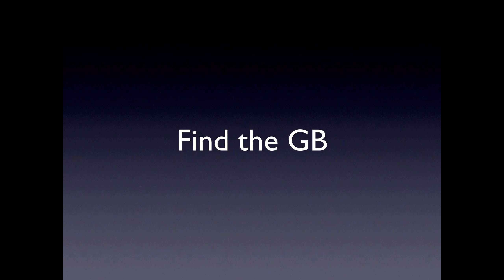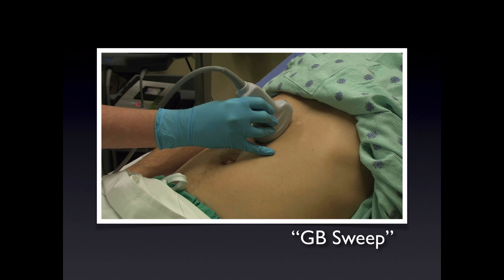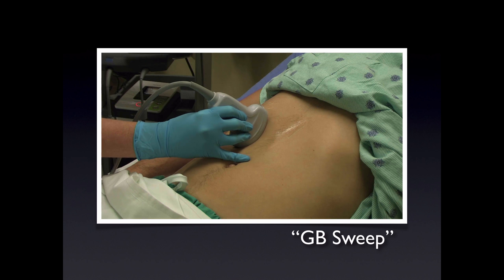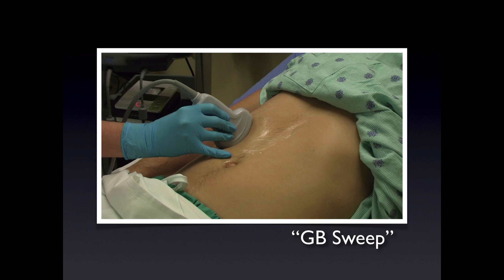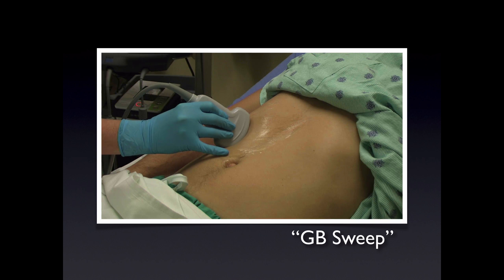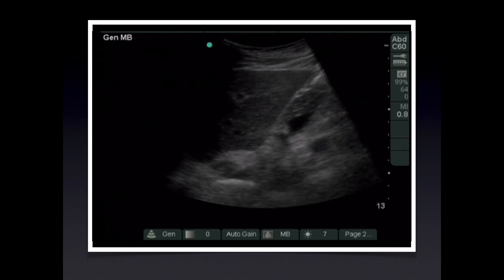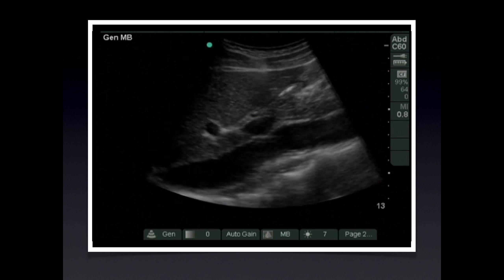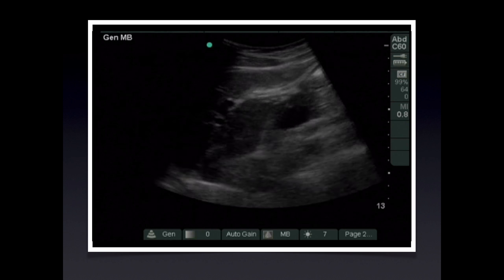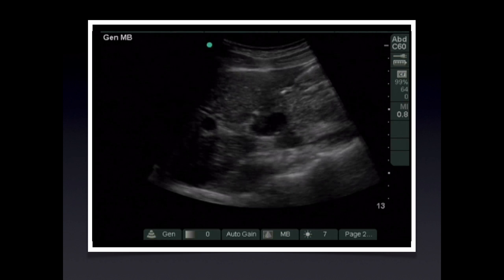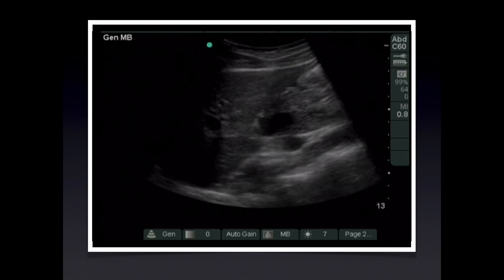So first, we need to figure out how to actually find the gallbladder. Place the transducer in the epigastrium and sagittal plane with the indicator pointing towards the head. Then slowly sweep to the right while pointing up into the liver and wait for the gallbladder and portal vein to come into view. This is the corresponding sagittal sweep. In the beginning of this sweep, we see only the liver and some adjacent bowel gas, and as we go more medially, we start seeing the portal triad, which helps us identify the gallbladder.